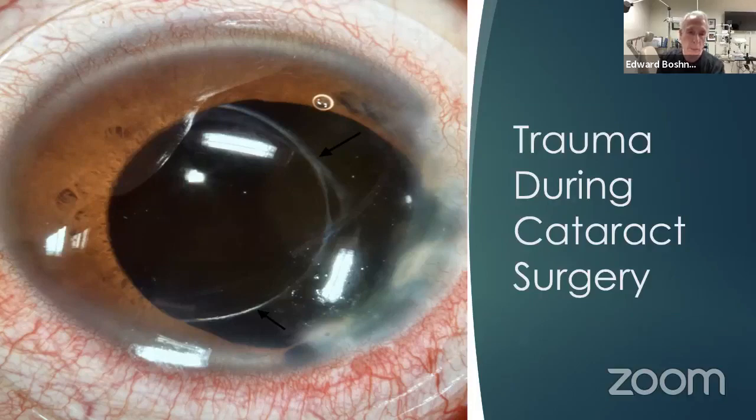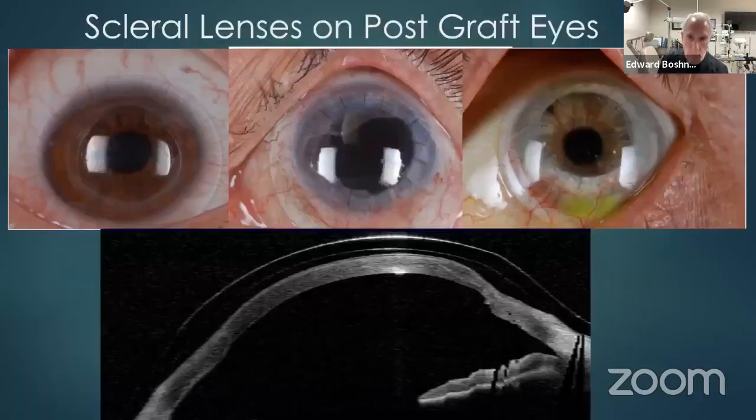And in any case, the patient's doing really well with this scleral lens. You can see the outline of the scleral lens in the top left. You can see the outline, top right also. These are three different eyes that we worked on with the scleral lens.